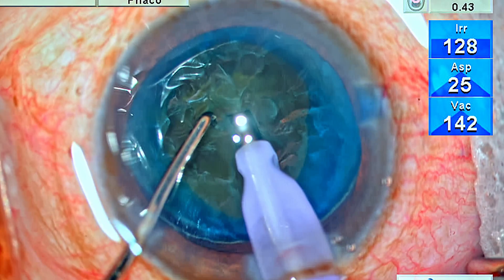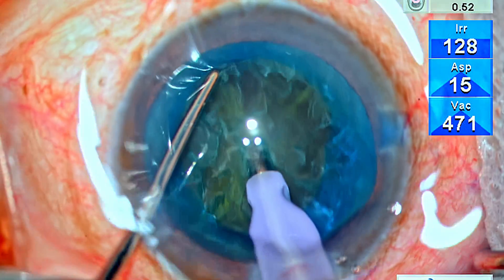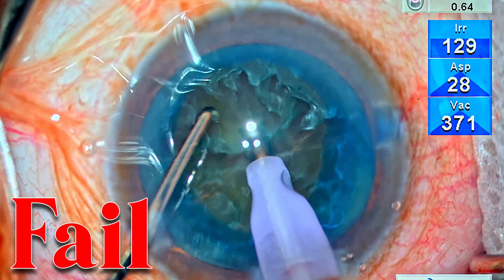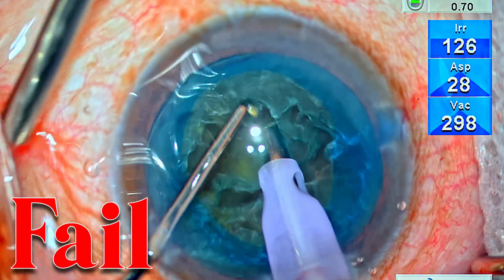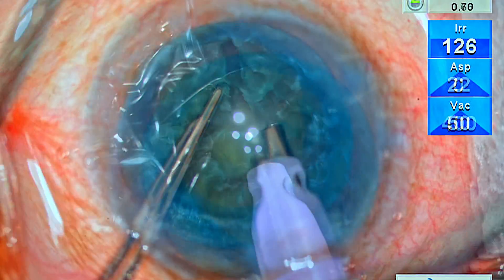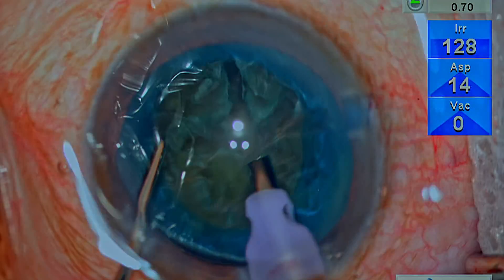Hi, this is Dr. Deepak Meghur, and I'm here to answer a very common query which I get. In some soft cataracts, we try to attempt a direct chop technique, and the nucleus is too soft — we are unable to get a hold and the chop fails. How do we cope in such a situation? Let me take you through one such case where looks can be deceptive.